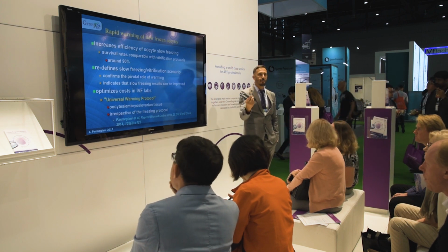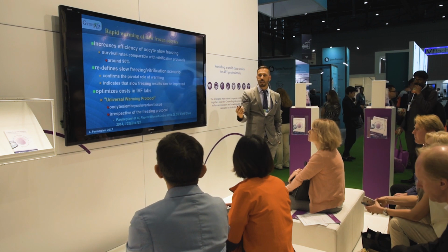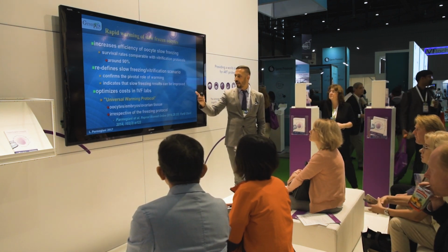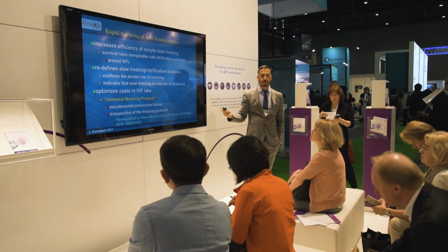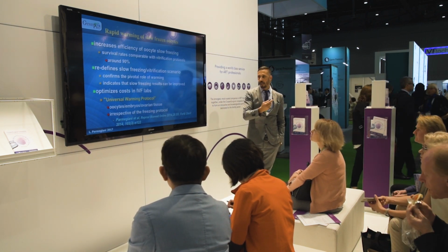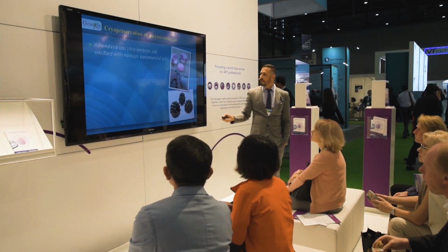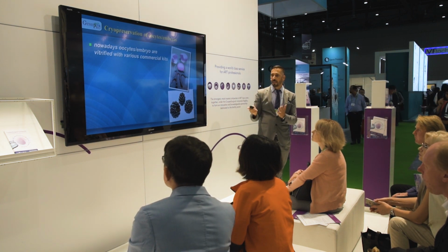Imagine that in your fridge you can have just one warming solution, and you can use that warming solution for any oocyte, embryos, ovarian tissue, irrespective of the freezing protocol, irrespective of whether this oocyte comes from your lab or maybe you received it from another center. So, how can we apply this in our daily routine?